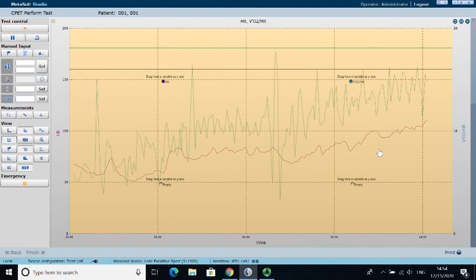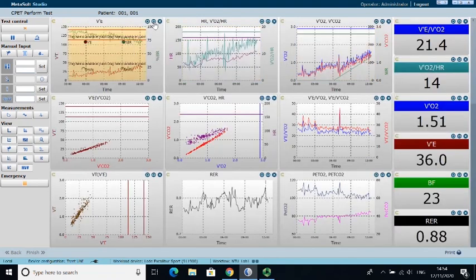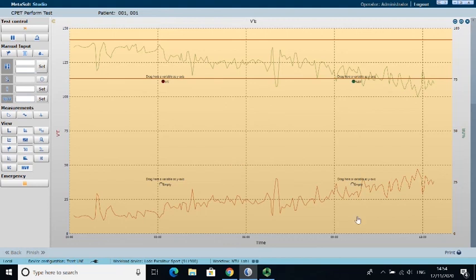But this is heart rate. This is to show you that heart rate is doing the same thing. If we want to use more oxygen, we've got to deliver it through the blood. So in order to do that, we need to increase our cardiac output, and we're going to do that by increasing our stroke volume and our heart rate. And we can start to see that this is ventilation creeping up a little bit as well.